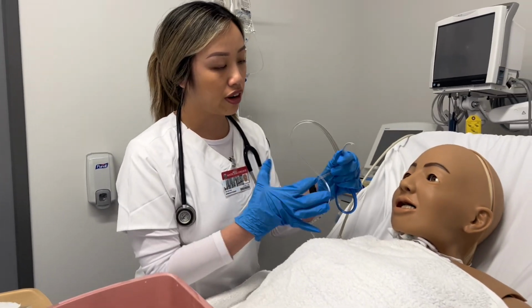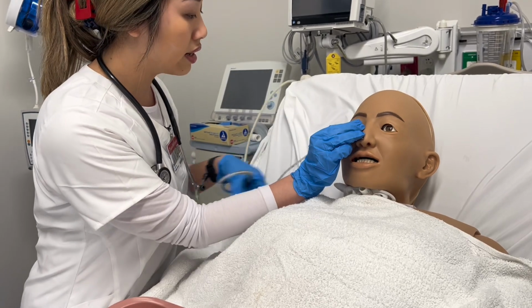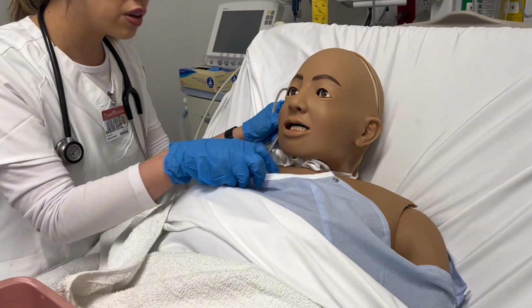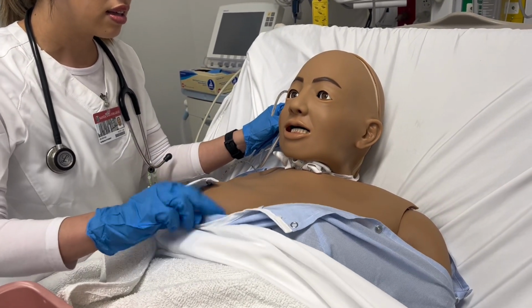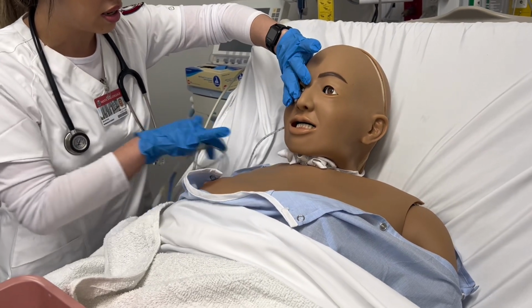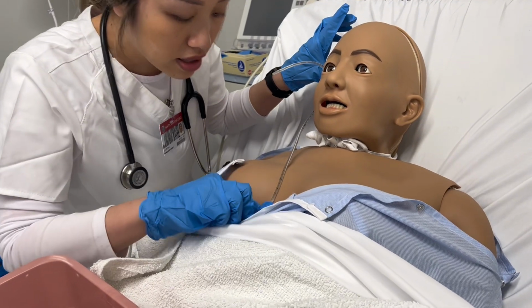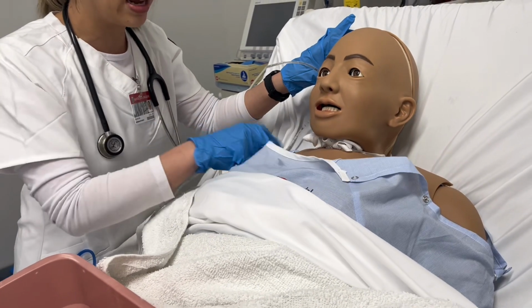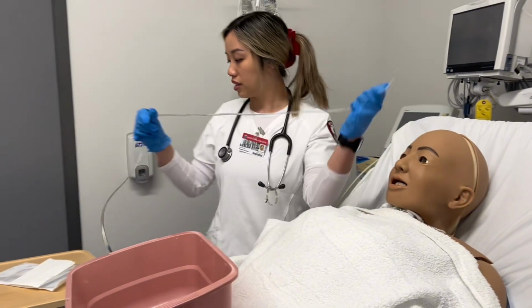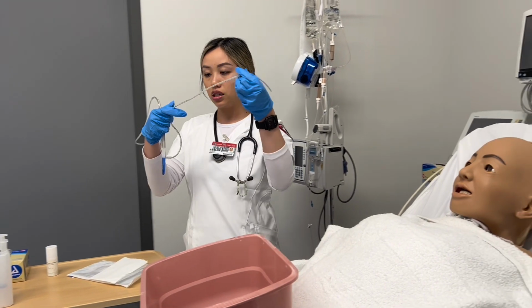So I'm going to measure from the nostril, and then I'm going to go to the ear. Okay, I'm just going to put this down, okay? So nose, ear, and then I'm also going to go to the tip of the xiphoid process. Okay, so it looks like the measurement's going to be at about 50. So I'm going to mark my tube at 50.